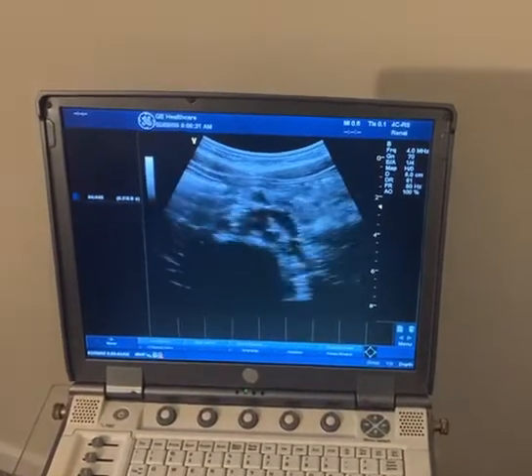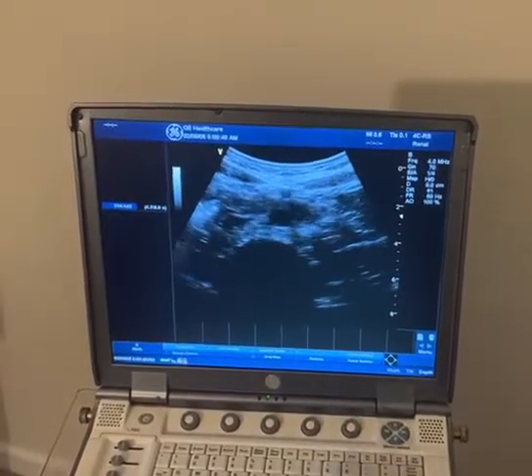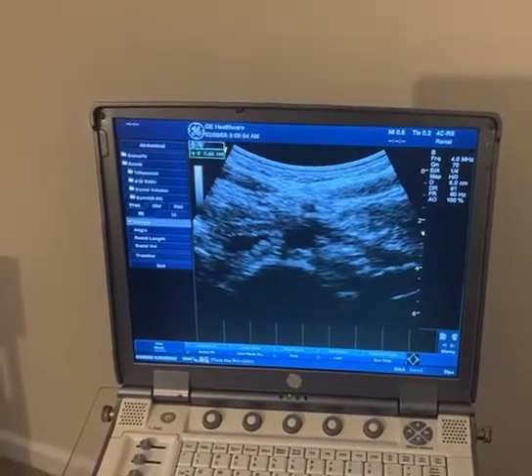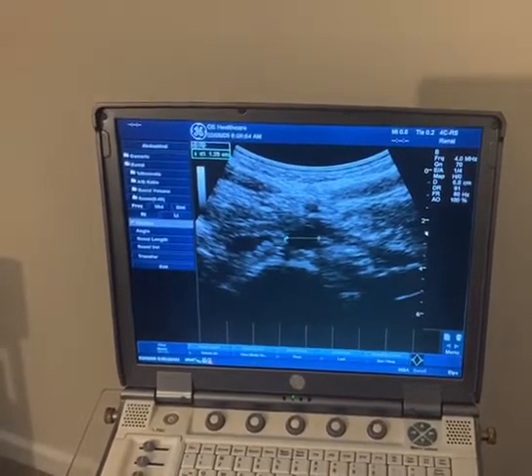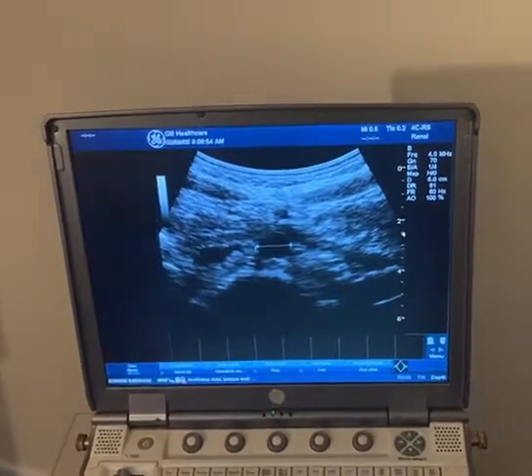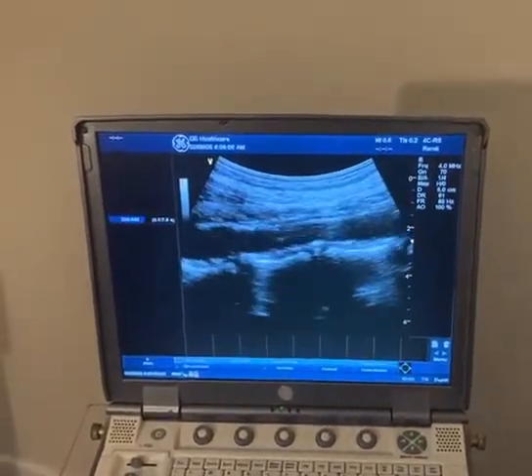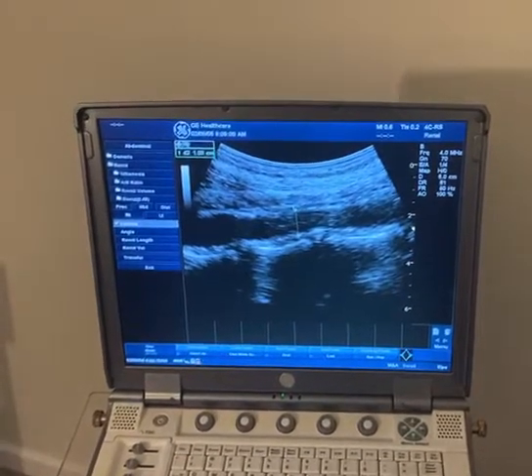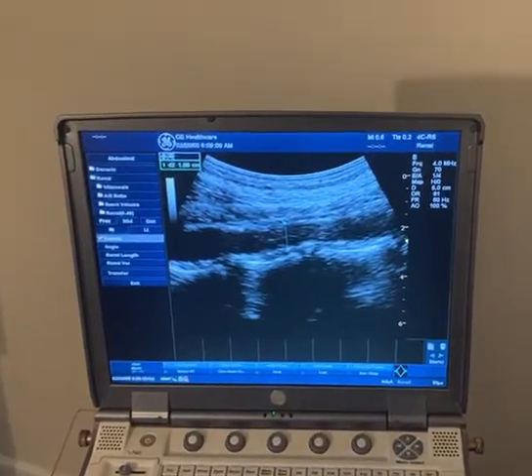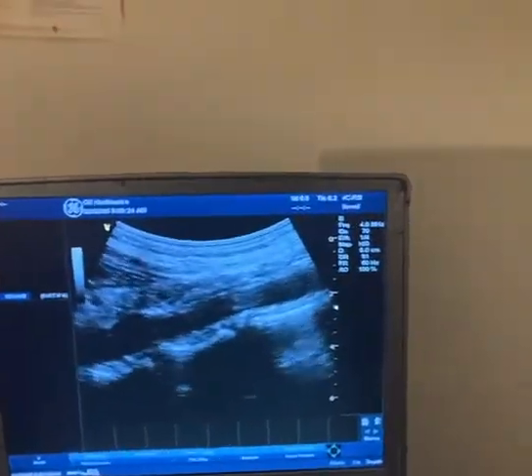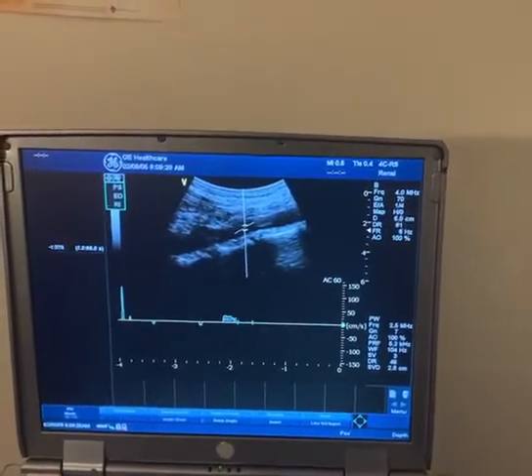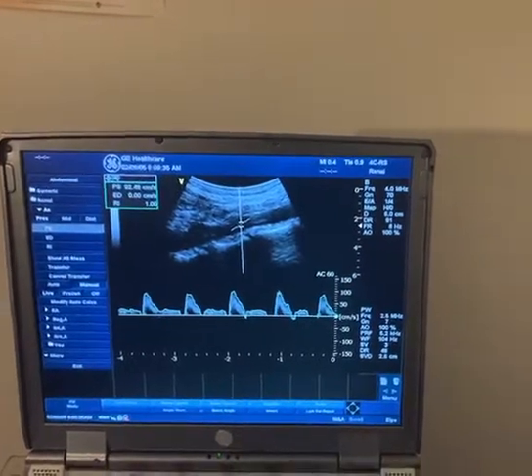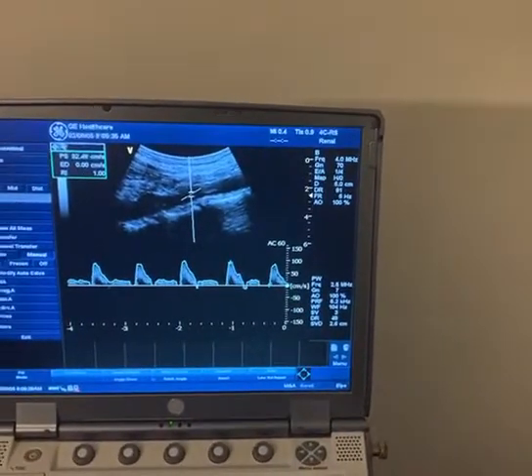I'm going to keep coming down now to the distal segment. I adjust my depth — that's my distal segment of the aorta in a transverse view. I'm going to freeze that and measure it — that's your transverse distal aorta, about 1.3 cm. I'm going to unfreeze and turn right on that distal segment to get a sagittal measurement of my distal aorta, outer to outer. I also get a Doppler velocity of the distal aorta. It's very important that you rock your probe to keep your vessel as parallel as possible when scanning so that you can get a good angle on your images.